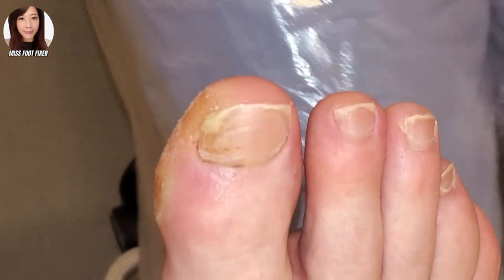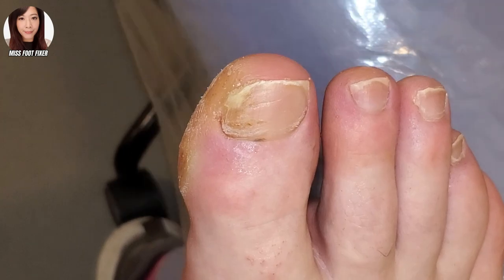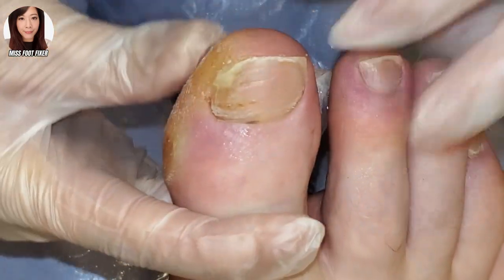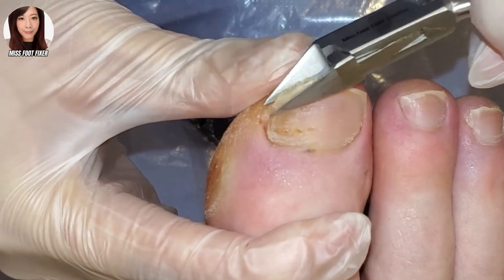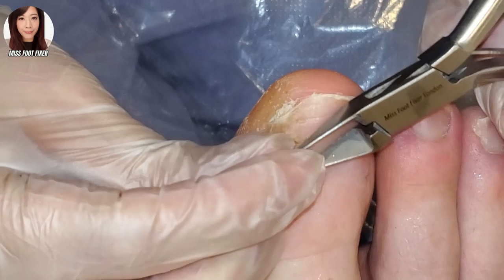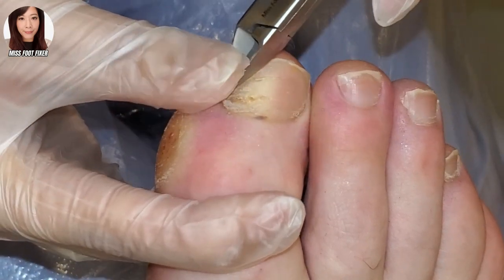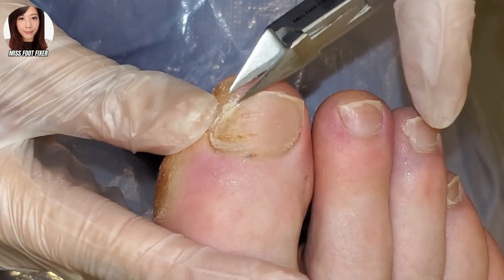What we're going to do now is just cut and clean down the nail with my nippers and shape it really nice, and just remove as much of the debris as we can. We can see that the nail is really, really thick, so we'll cut it like that. It should be relatively easy, and this is a relatively easy job because it's only a section of it.